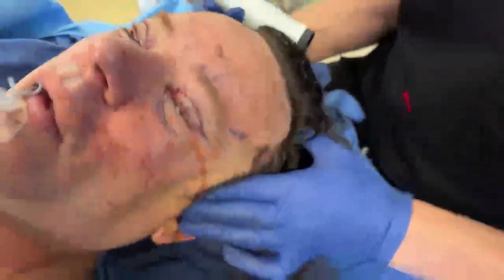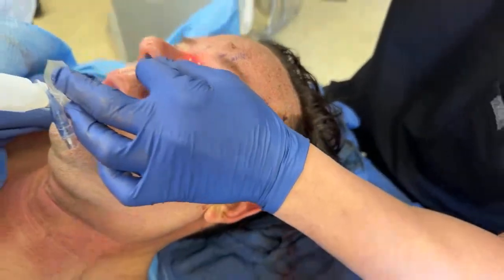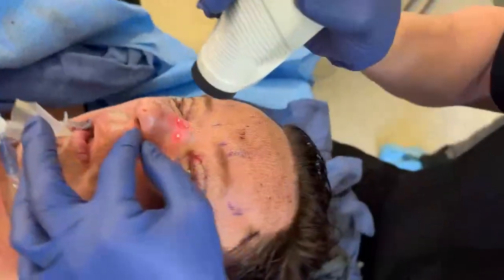Remember, he's got metal shields in protecting his eyes. You cannot perform this procedure without them.